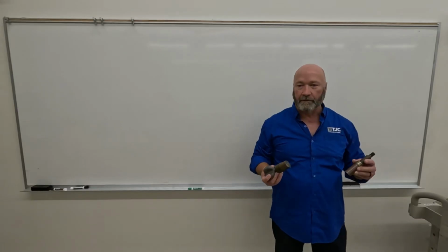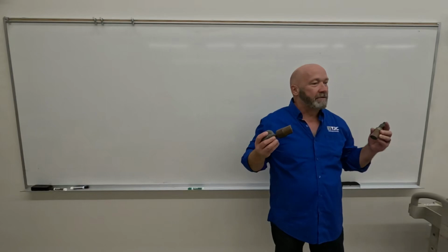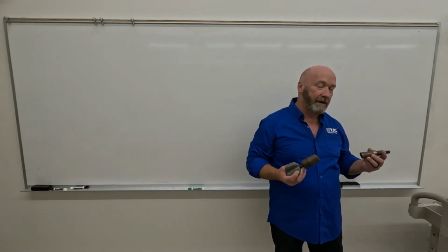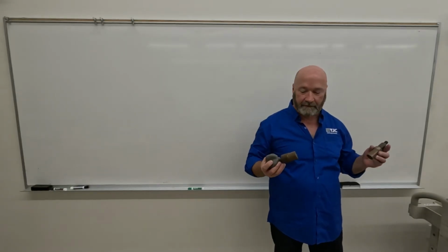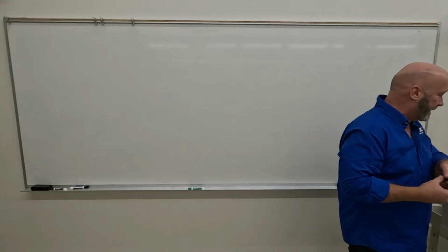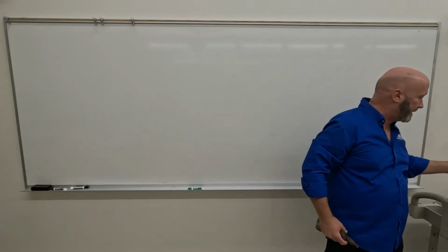You're never going to work with a machine that doesn't have a rotating anode. So the only place that you might see these again is in a dental unit, something like that, which you're not going to be working with, but still they're on the registry, so we have to talk about them. So these are stationary anodes. This would be, and you can see where it's broken off the back, a rotating anode.